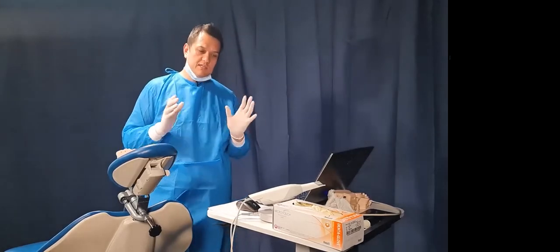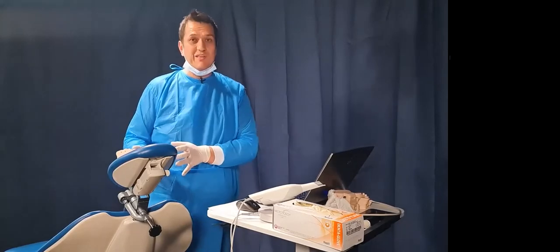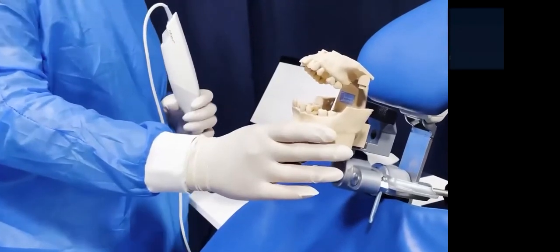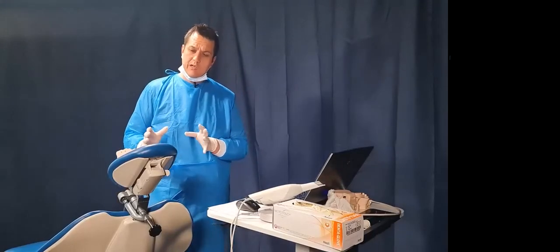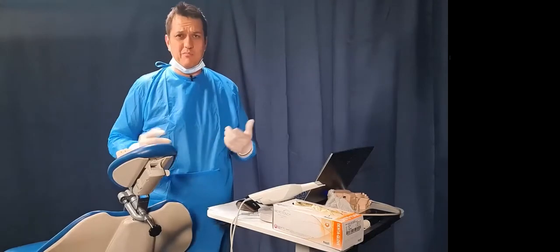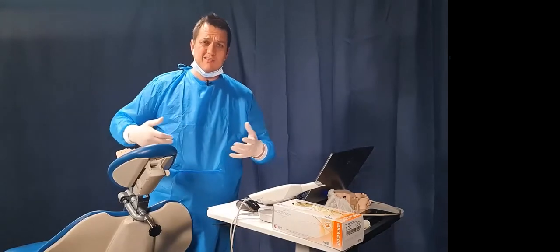So in a denture scan, sometimes you are intimately looking at that screen, but you are looking at that patient as well. We have a mannequin model of a real live patient on a chair mount today, which is a really great way to learn. And so we're going to have a quick look at a single tooth missing. Now you might think, oh, come on, Leif, I'm looking at this for the advanced stuff. Well, funny enough, one of the things people ask me most is, I just can't get the undercuts on that single tooth.